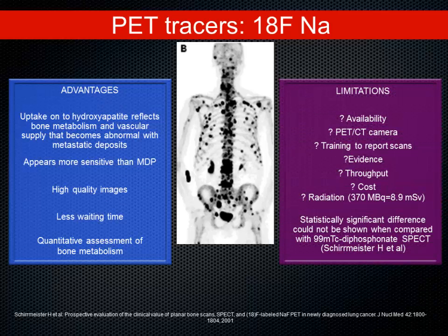But what are the problems if you switch? It's a question of availability, and although we say PET-CT has revolutionized practice, a survey within the European Union found that only 10% of the departments have PET-CT scanners. So there is still a potential role for nuclear medicine and MDP. Training to report scans is not as straightforward as MDP, because with MDP we know the ins and outs, and what problems you are facing.